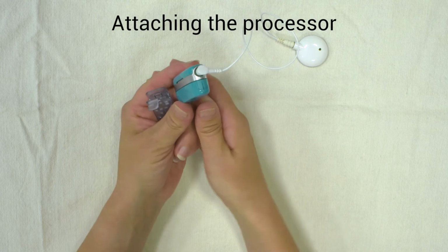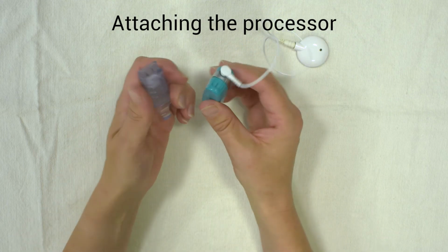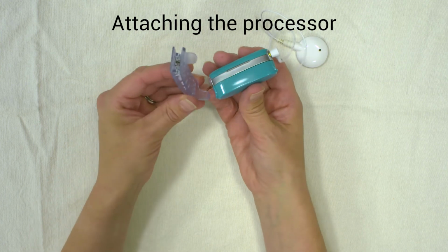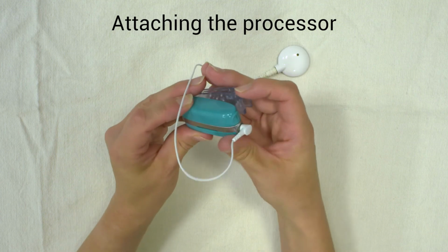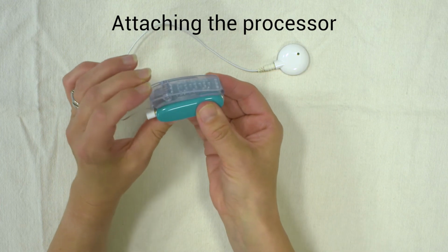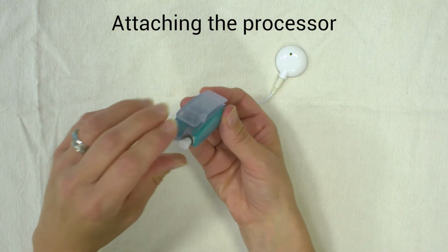In order to clip the processor onto the patient, there are various options. You can get harnesses to wear on the child. This is the most commonly used way. It's a clip that can be attached onto the processor. And then you can clip it to clothing. Sometimes children will wear a vest under their top and then clip it onto that. Or if you're using the long lead, you can clip that to the top of trousers.